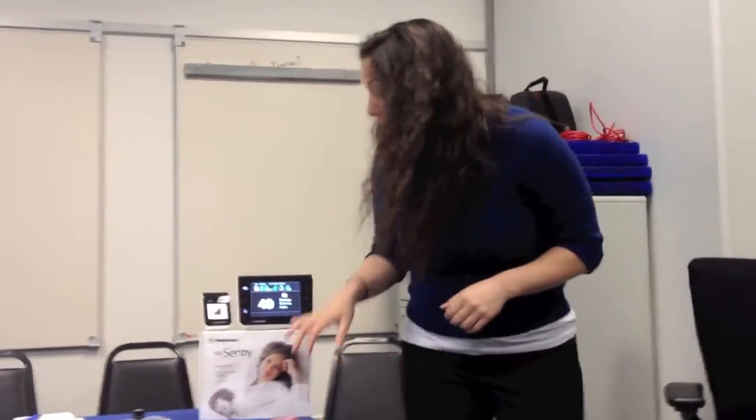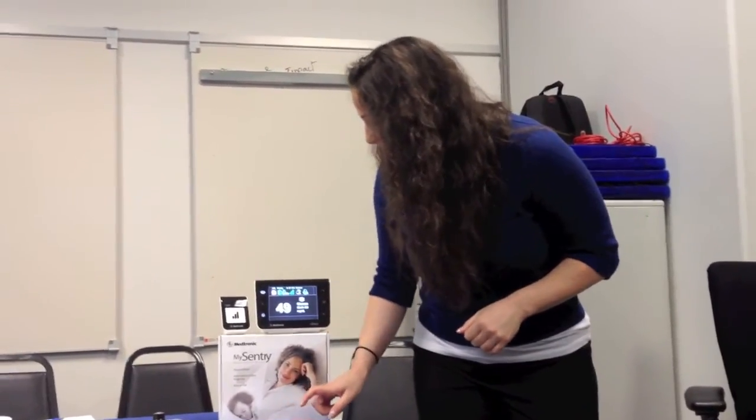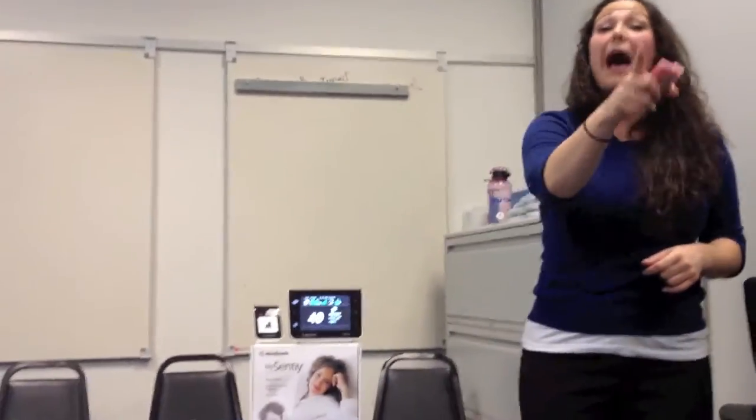Let's interrupt Matt. Definitely. What is his threshold that he's not alarming? So actually, it should be alarming, which is... Actually, what I think may have happened is that I may not have set the threshold on this pump, and so if I didn't set the threshold, then you wouldn't have anything. So that's why we're not alerting just yet.